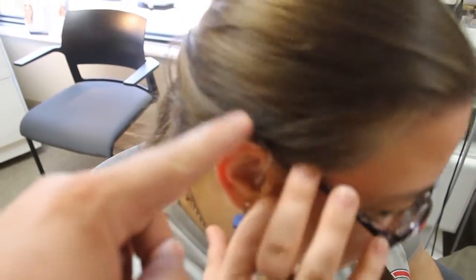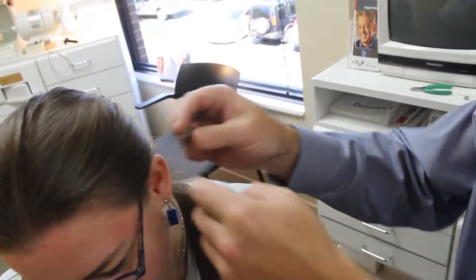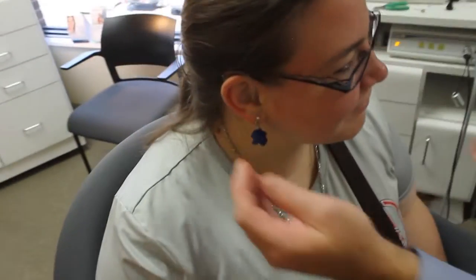There's a tube that goes right here from the ear to the hearing aid, and he snipped that down to size. And now, you are in stereo.